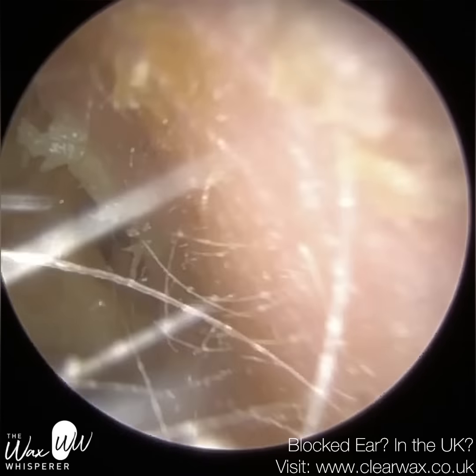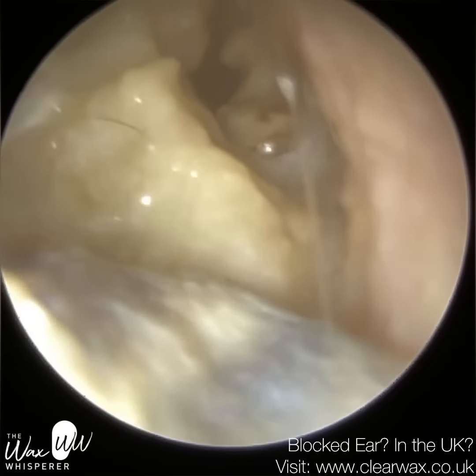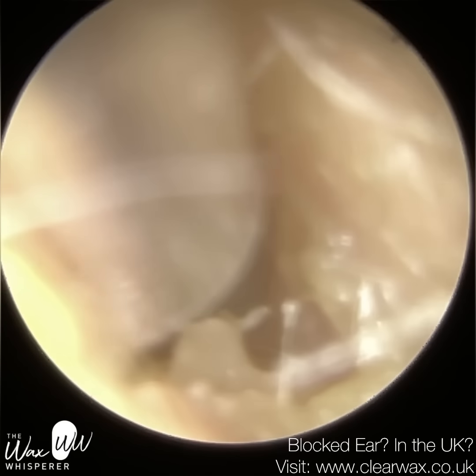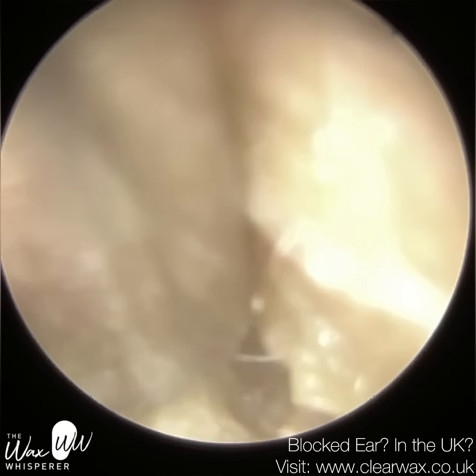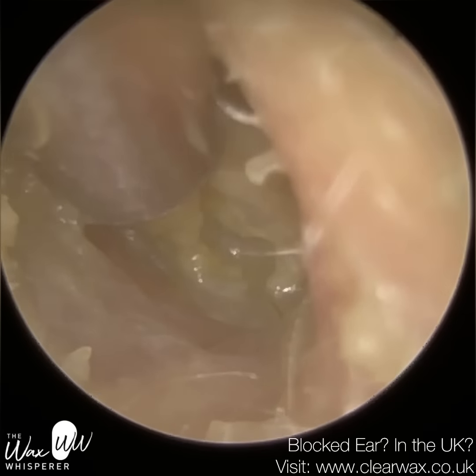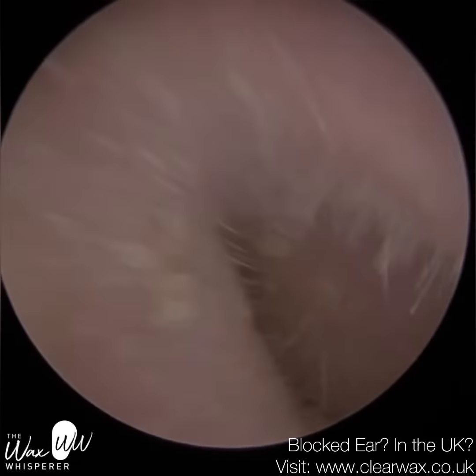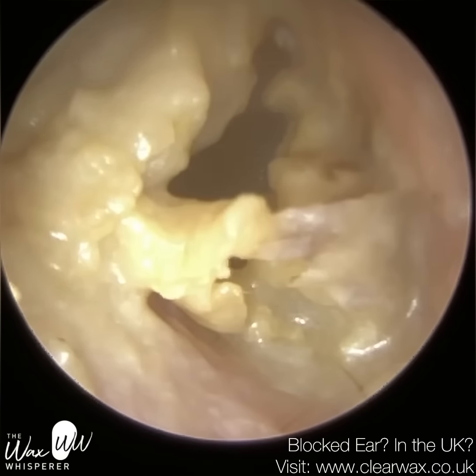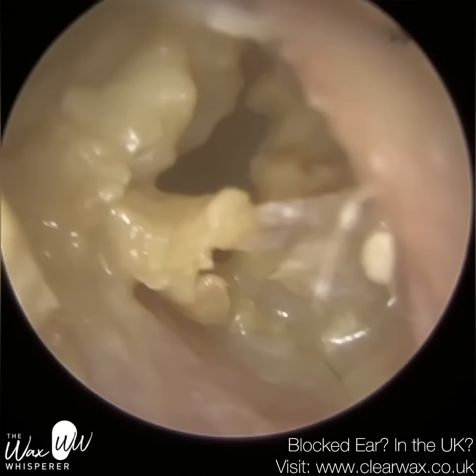And now this right ear, you can see it's a bit more spores. You've got this kind of almost like black mold developing on the surface of the debris. So we're just trying to remove this, but the ear canal was quite inflamed. I'm just going to go back in with the endoscope to really stretch open the ear to provide access for the instrument to go into the ear.